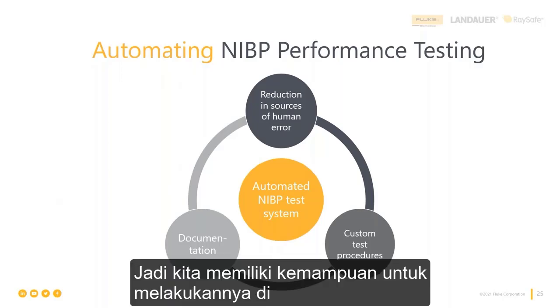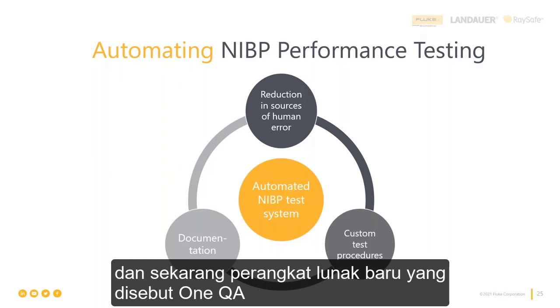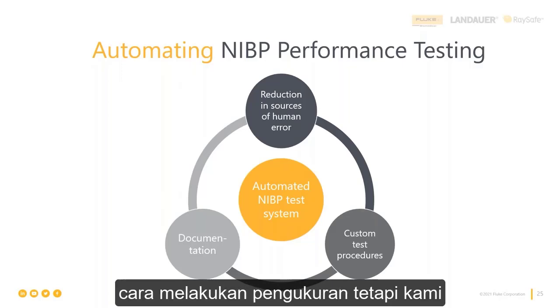Okay, so we have the ability to do that in two softwares that we had, our older software called Answer, and now the new software called OneQA. So right now we would create this efficient, but not necessarily quite yet interoperable way of making the measurement.